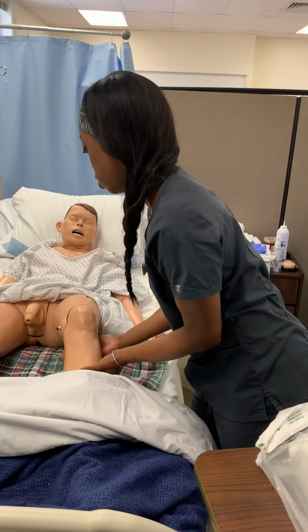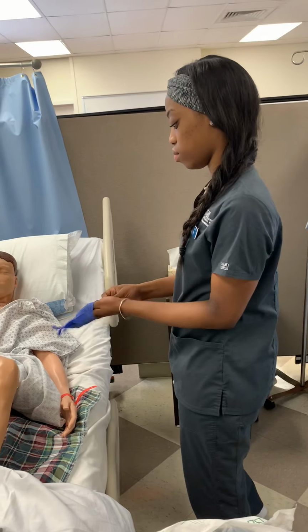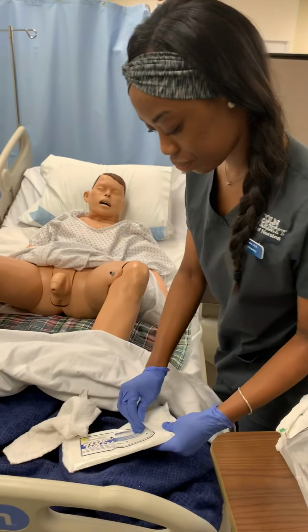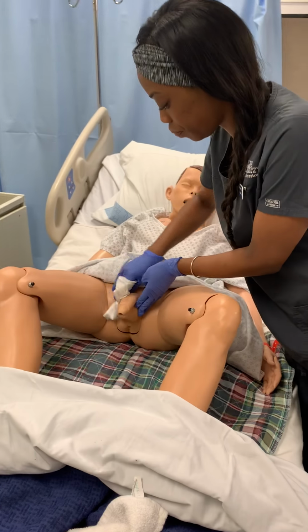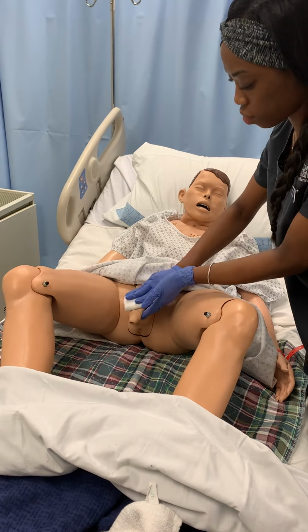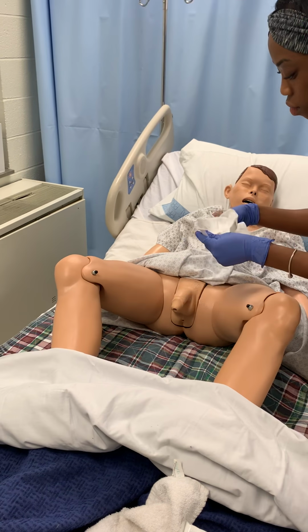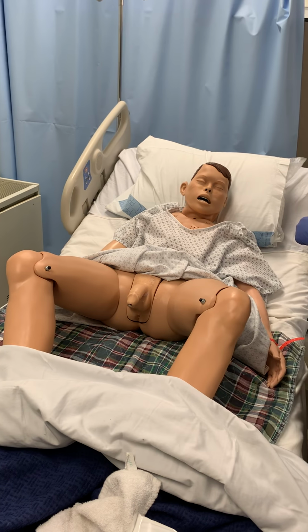Now I put him into position where I can easily perform perineal care. I will put my gloves on. The supplies you need are wipes and a towel to dry. You just wipe the area. Make sure to ask the patient if he's doing okay. How are you doing? Okay, he's okay.